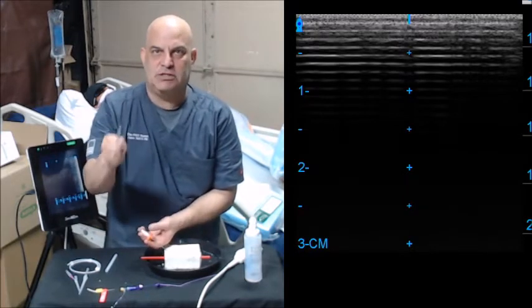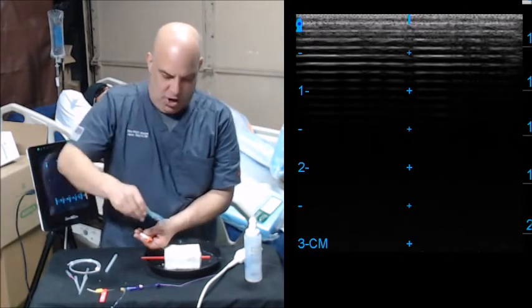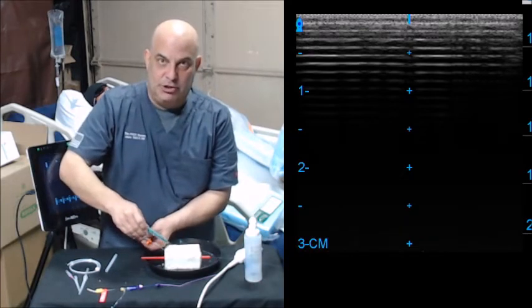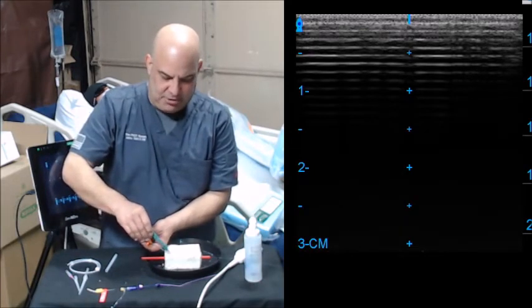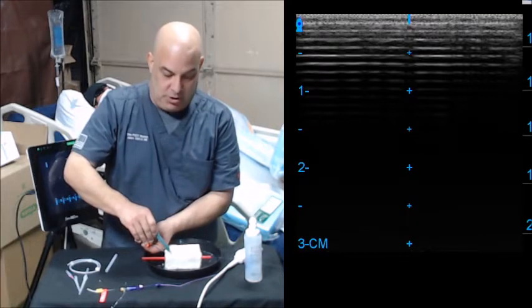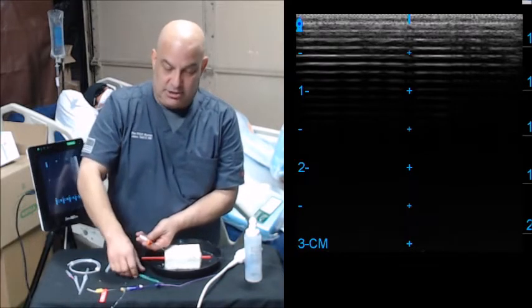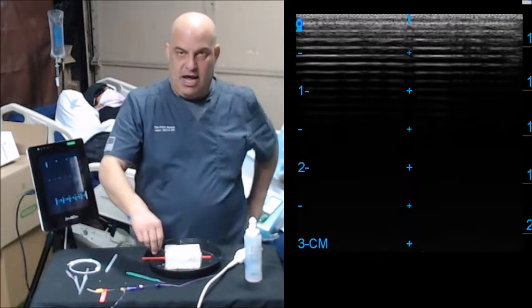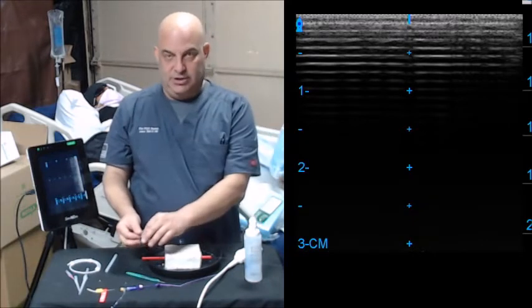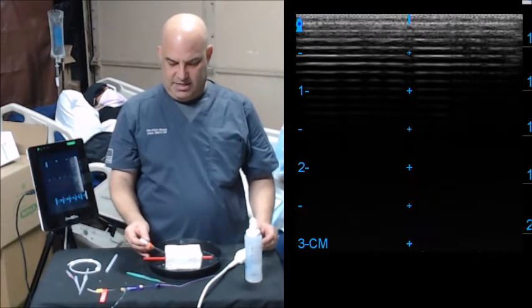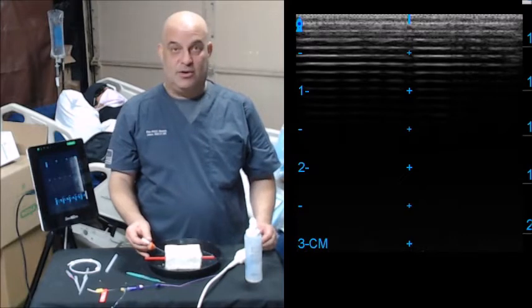this is what every PICC nurse company needs you to know, right here. Right before you drop the introducer you've got to be able to just poke a little hole right in the skin, not the vein, the skin, and then advance your needle introducer right there. That's the whole thing.